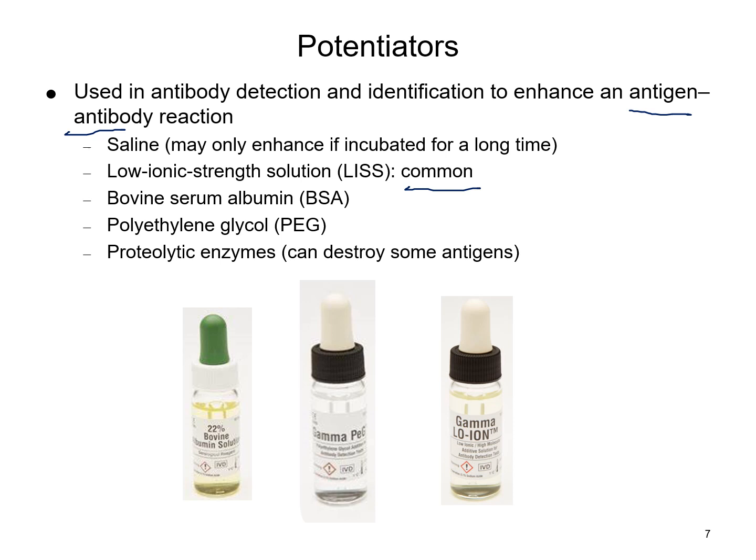And depending on the manufacturer, that incubation time is usually 10 to 15 minutes. I think some of them could go up to 20, but typically a 10 or a 15-minute incubation, just depending on what your procedure says for that particular reagent and what your blood bank does with it.